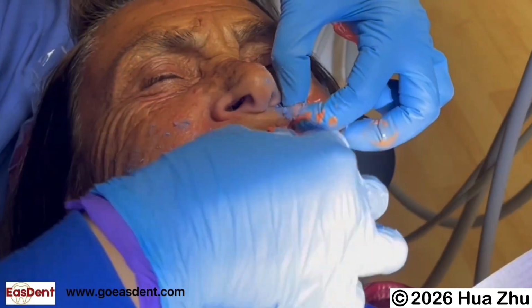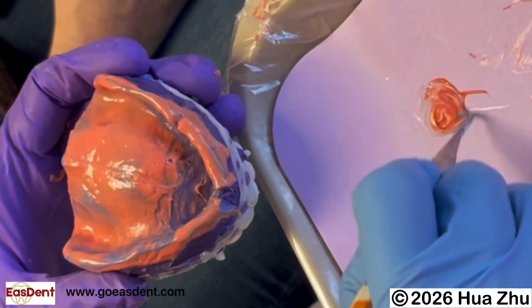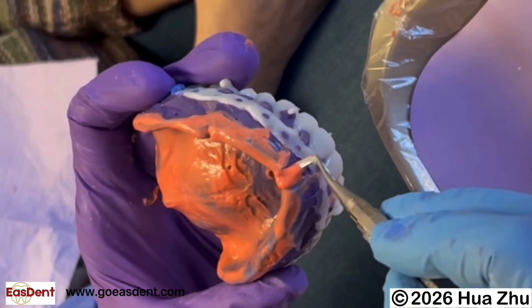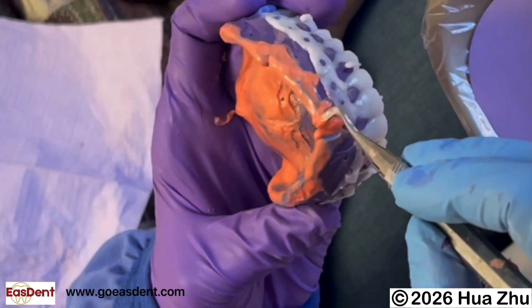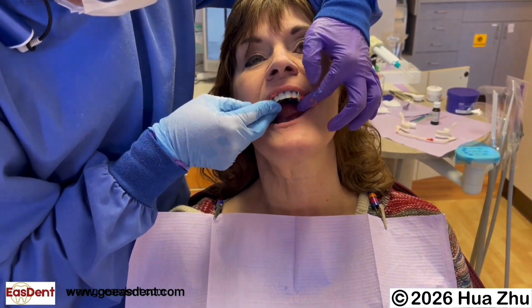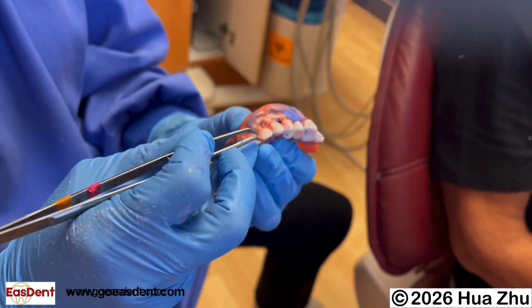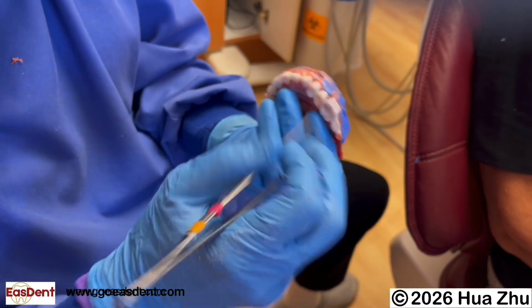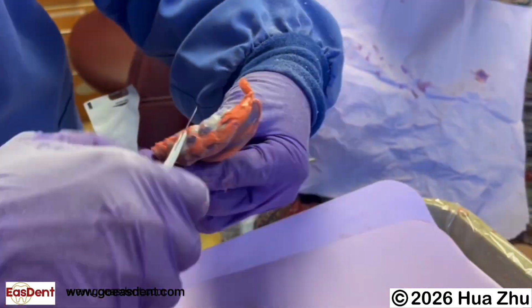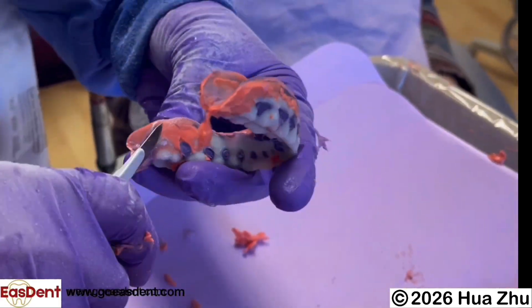Clean away extra impression material before the material is set. If necessary, you can repair the impression with a little more light body PVS impression material or sticky wax, the same as what I showed you for repairing maxillary impression. After the material is set, make sure no impression material is left on the occlusal surface to interfere with the occlusal contact with the maxillary arch. Cut away extra impression material on the buccal lingual flanges.